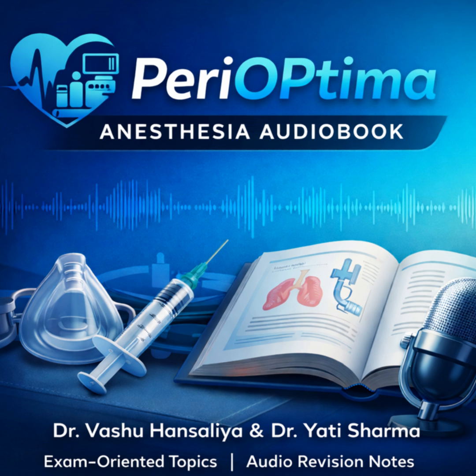What else is an absolute contraindication? Aortic dissection, absolutely not. You do not want to be inflating a balloon against a dissected flap or, God forbid, expanding a false lumen. You'll rupture the aorta.